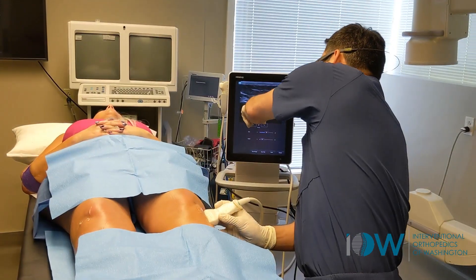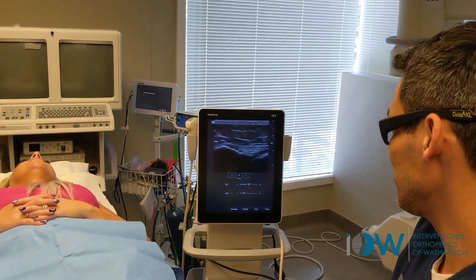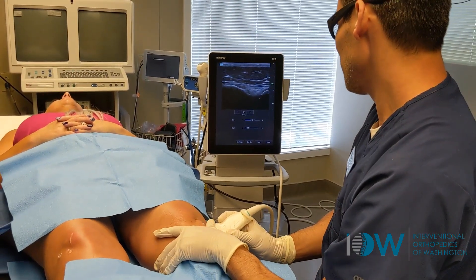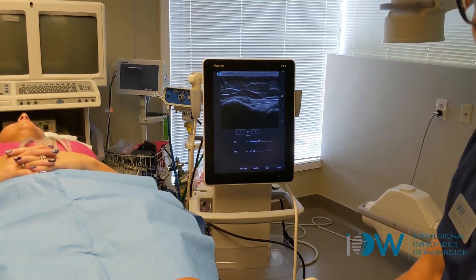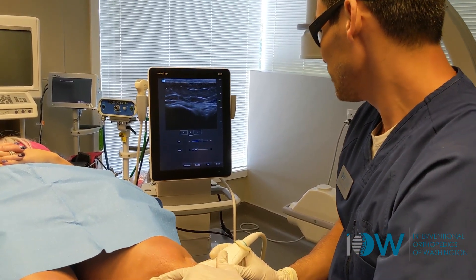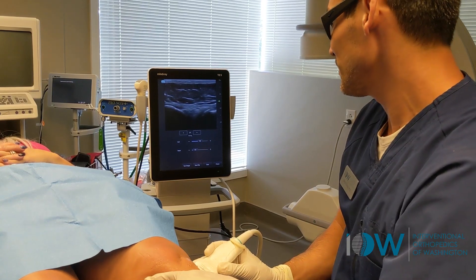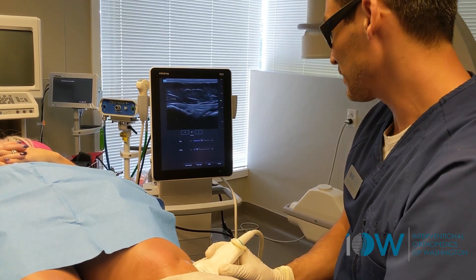Right here we have a joint line, one bone, another bone, and that's the lateral collateral ligament right there we can see. And we can see if the LCL is doing its job — meaning if the joint space is widened, noting mobility, unusual mobility of the joint space — then we know that the LCL is somewhat lax.